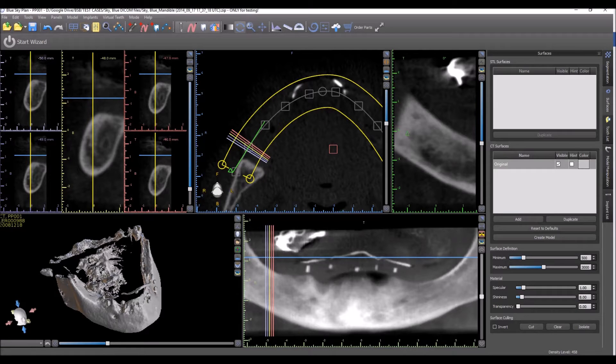We're going to take a look at the process of turning an edentulous ridge into an STL model that could be used to reduce the bone or to create a surgical guide.